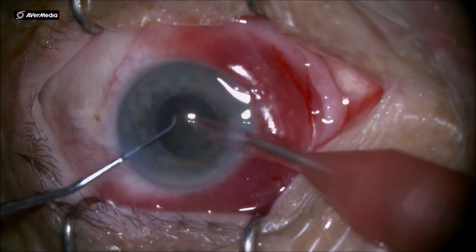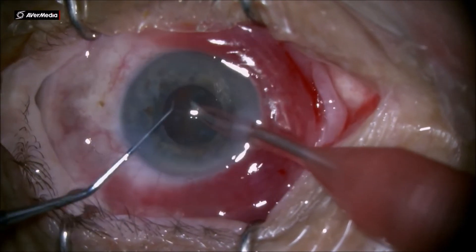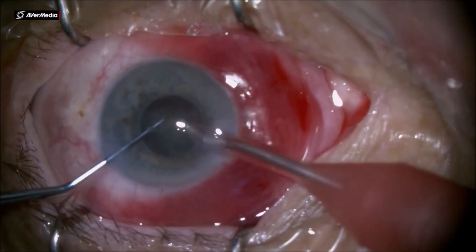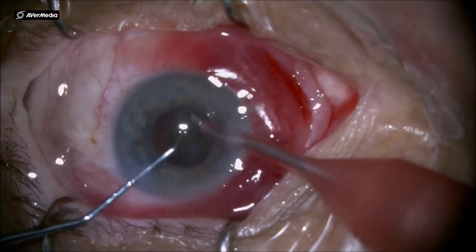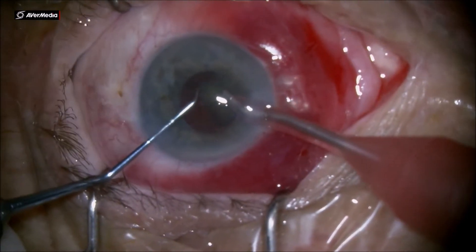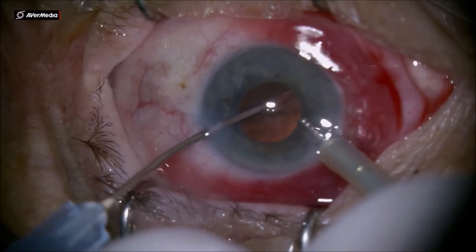You really need to stay patient in these cases and not hurry at any point, since you have a small anterior chamber and a very fluctuating posterior capsule. Glaucoma patients always have problems of posterior capsule laxity and it's very easy to aspirate it if you keep the foot pedal pressed longer than you should. Small acceleration and release the foot pedal, and you finish the case pretty steadily.